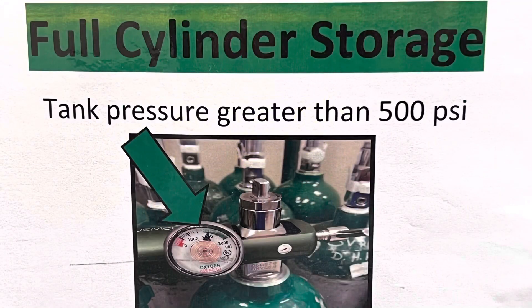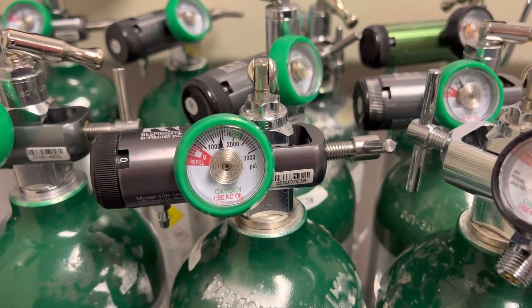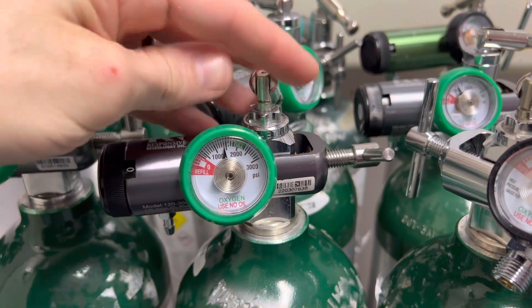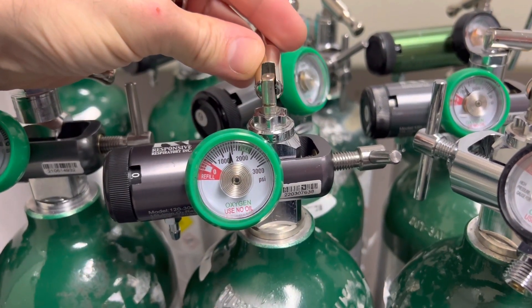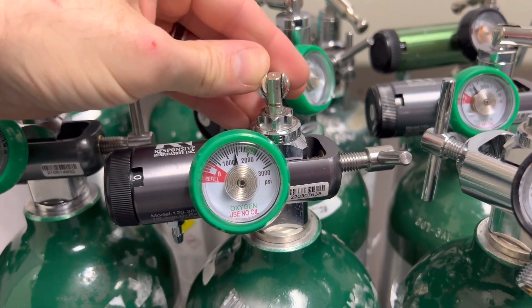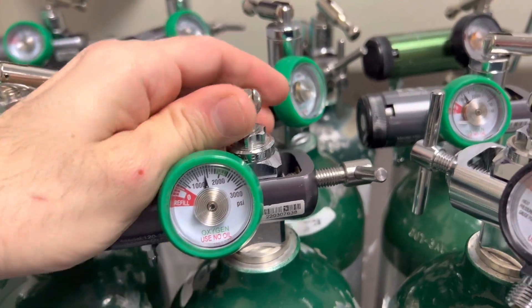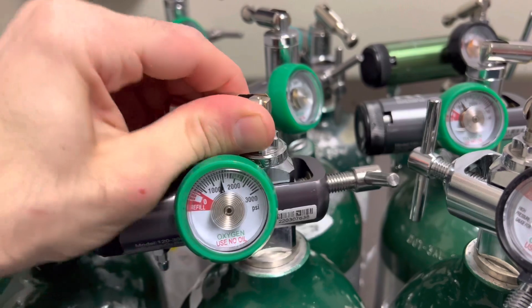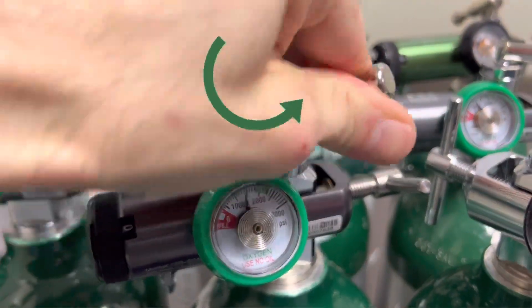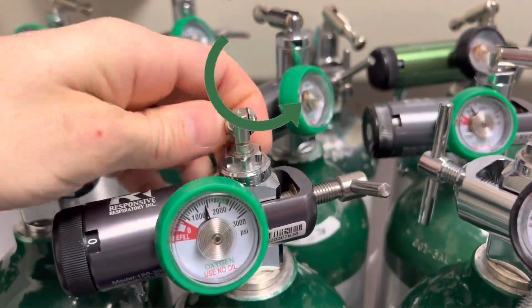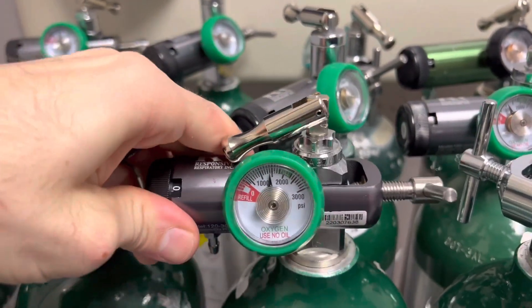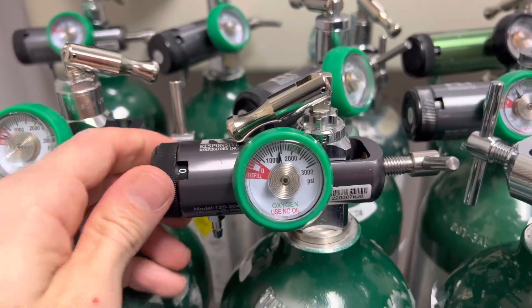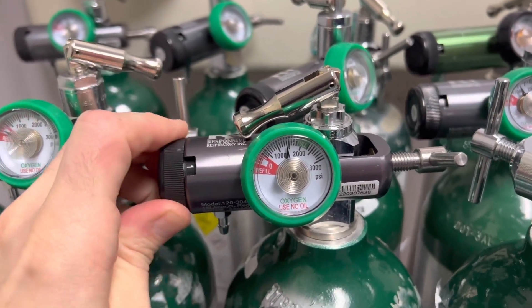First, select an oxygen tank from the full cylinder storage rack. Per OSHA regulations, the tank valve should be closed or off when not in use. Begin by rotating the toggle counterclockwise at least one full turn, then rotate the flow regulator knob to the desired flow setting.